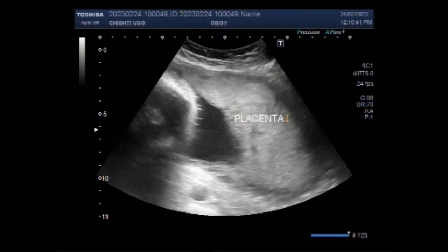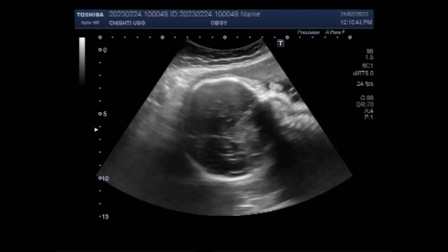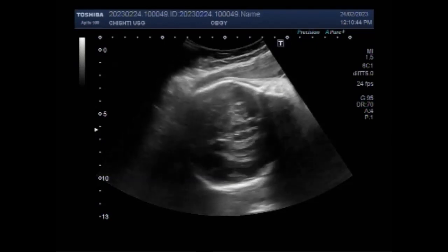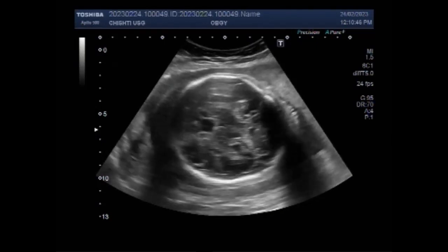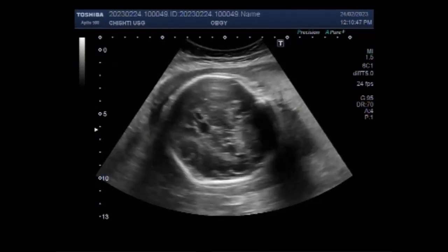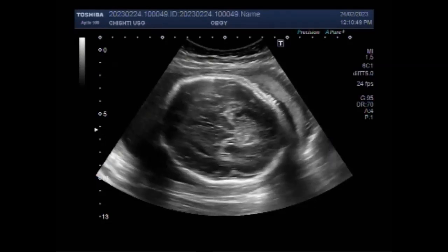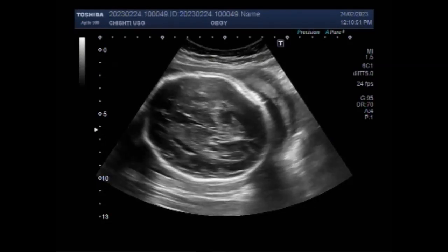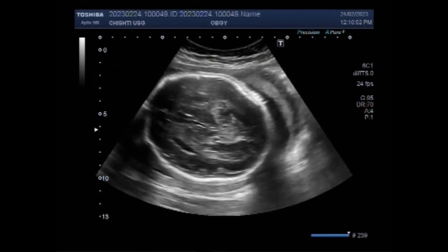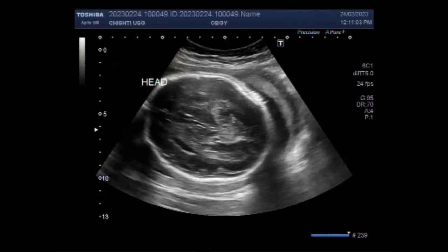Fetal ultrasound ultrasonography is the most important tool to provide prenatal diagnosis of fetal anomalies. The standard of static ultrasound examination includes documentation of arms and legs. A congenital limb defect is when an arm or leg doesn't form normally as a baby grows in the uterus.